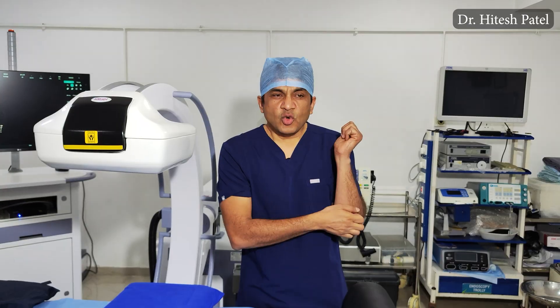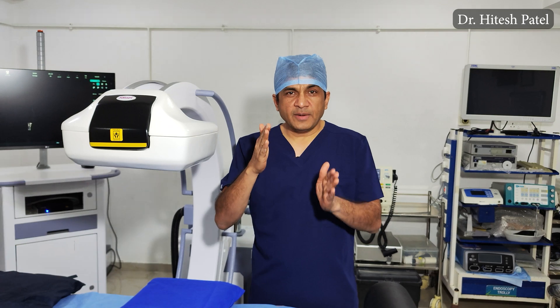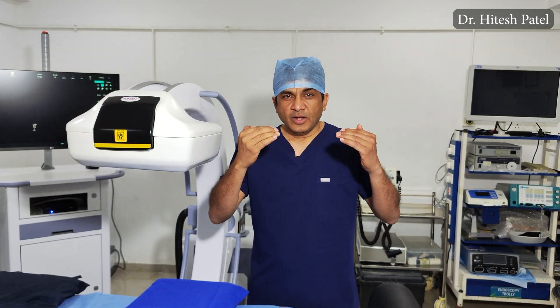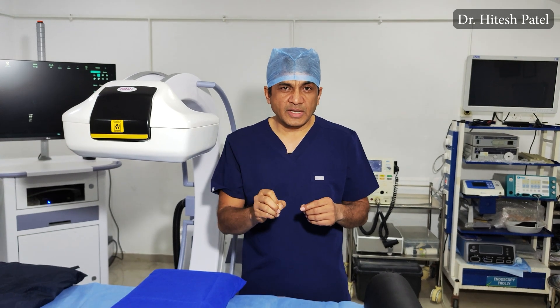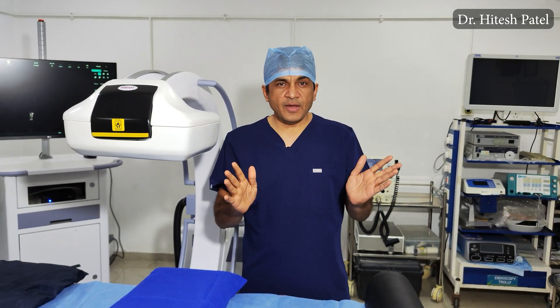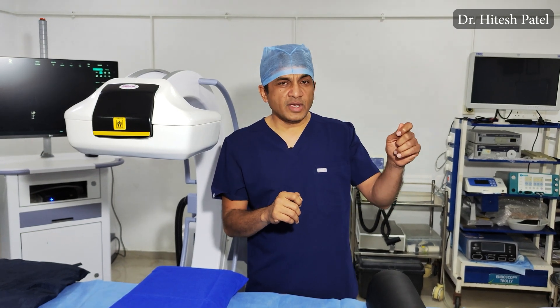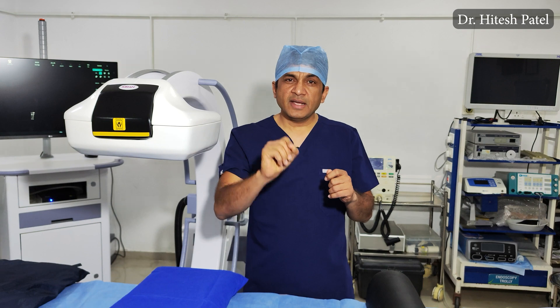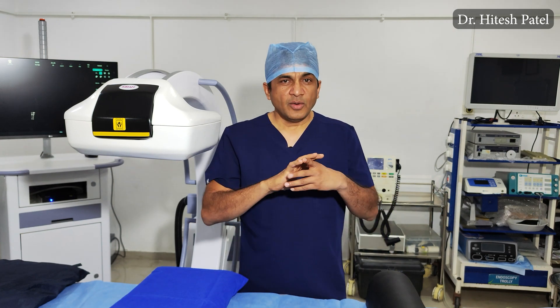Let us understand the position of the C-arm during the lumbar transforaminal neuroplasty procedure. If you understand the radiological anatomy of the lumbar spine in one procedure, you can do all lumbar procedures very easily. Understand the C-arm view in the AP: the end plate parallel, the spinous process in the midline, oblique right or oblique left opening the foramen or the facet joint. You can do the facet procedure, transforaminal, vertebroplasty, lumbar sympathetic injection — everything very easily. When looking at the X-ray, look at the spinous process, pedicle, lamina, transverse process, and foramen to understand the radiological 3D anatomy for the lumbar spine.